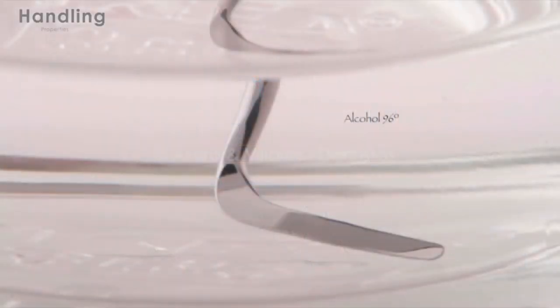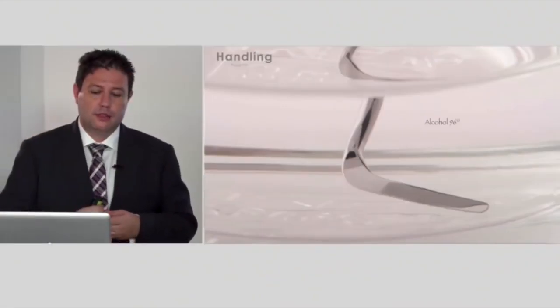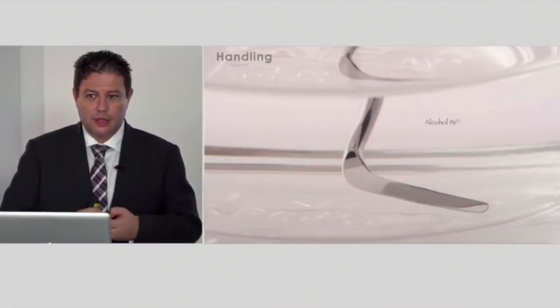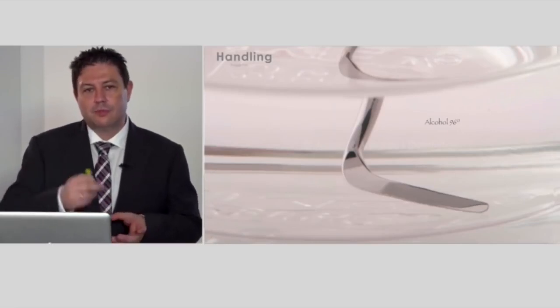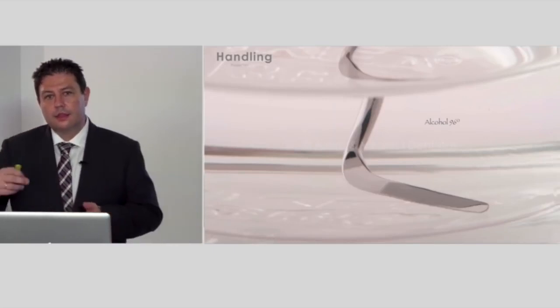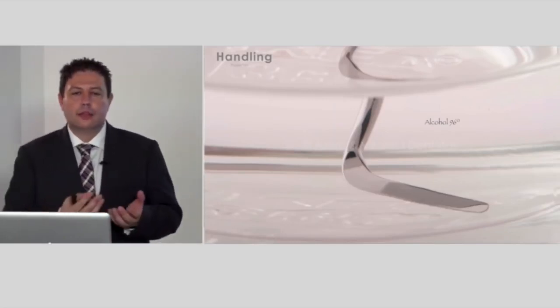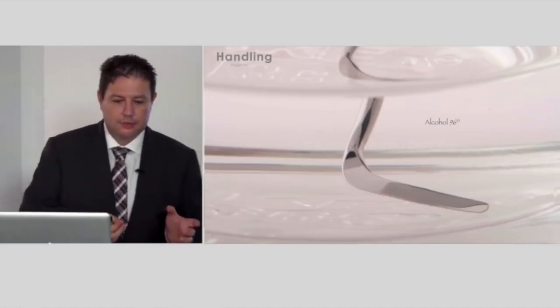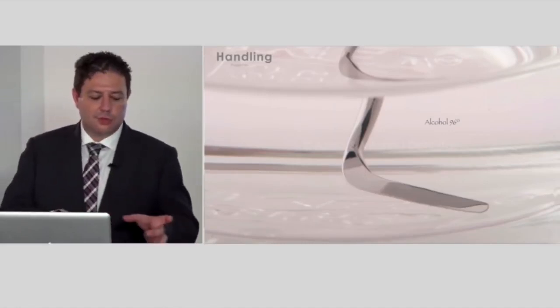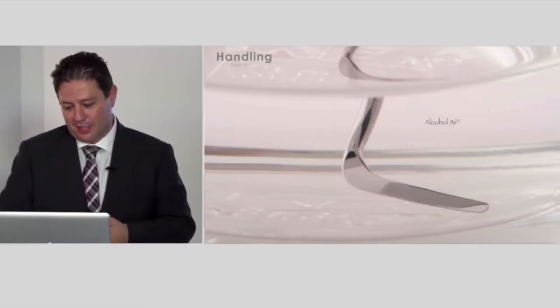There are other people who say that they don't want some remains of small hairs of the gauze on the spatula, so they put the spatula into a glass of alcohol, and then they dry it in the air to have a very dry material. But sometimes for me it's not so good to have a glass of alcohol there working next to the patient.